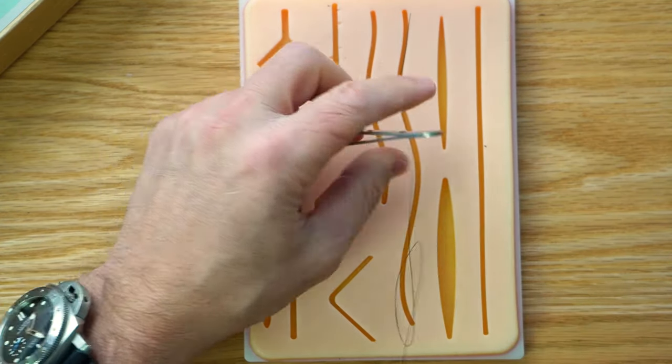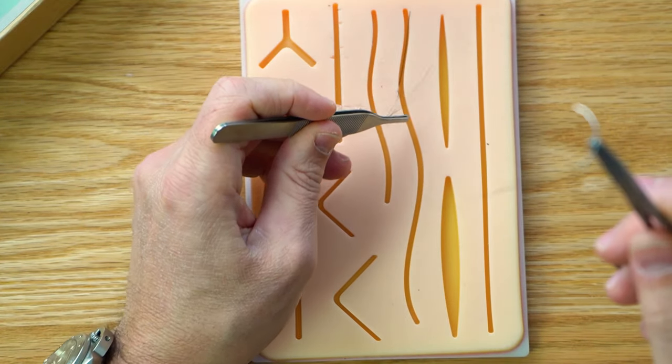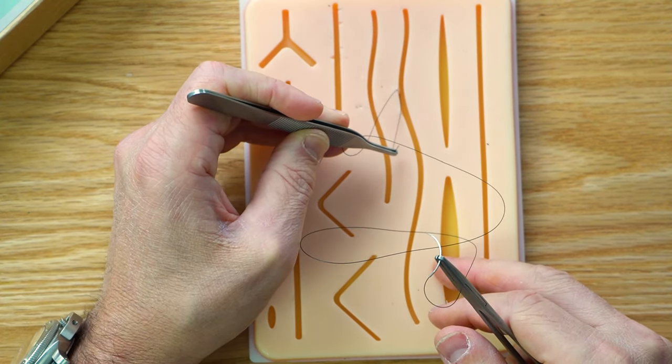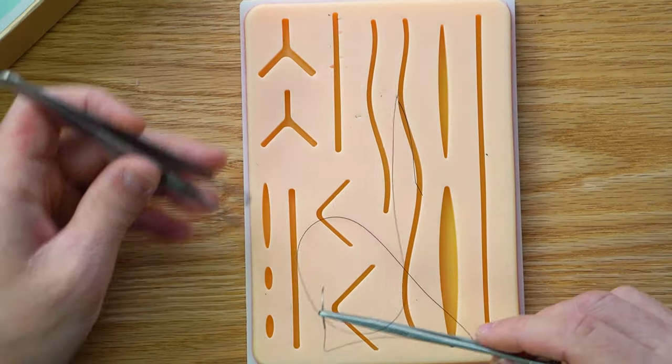So I'm going to grab this suture here, and actually I want this to be on this side. Now this is a little bit tougher. Most of the time I use Vicryl, 4/0 Vicryl, to close the skin, but a lot of people use monocryl as well. So we can do that. You can use either one. Okay, so note where my hand is.